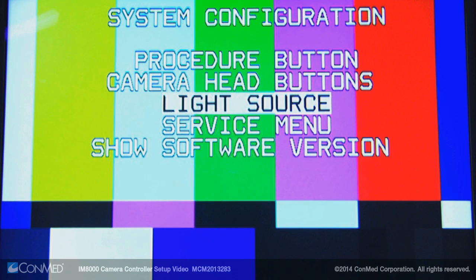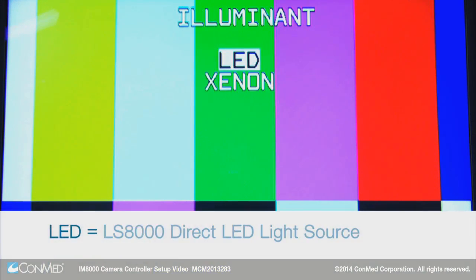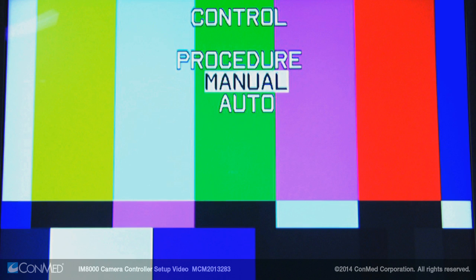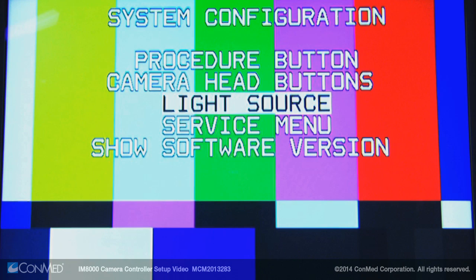In the light source menu, there is the option to select the illuminator. Choose between the LS8000 direct LED light source or the LS7700 xenon light source. The control option allows you to either use the procedure preset's optimized setting, manually select the brightness from the front of the console, or have the light automatically adjust to the camera's demand.